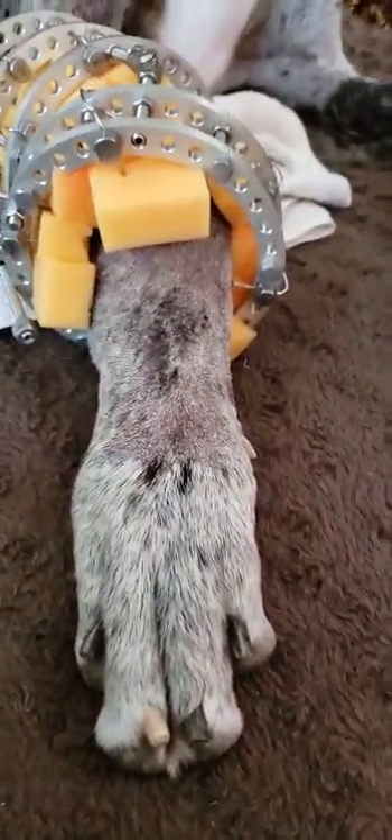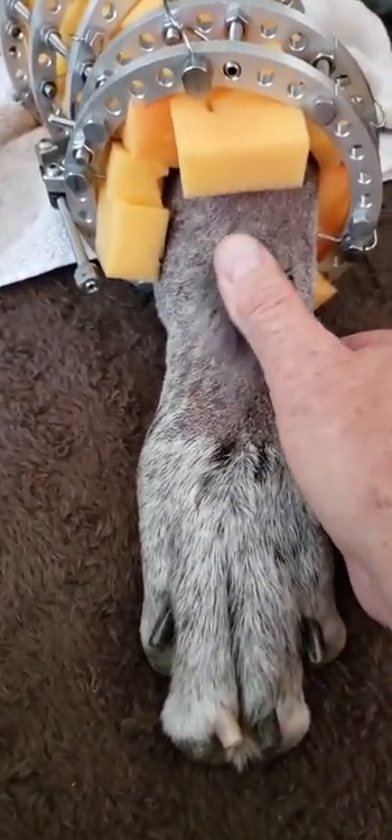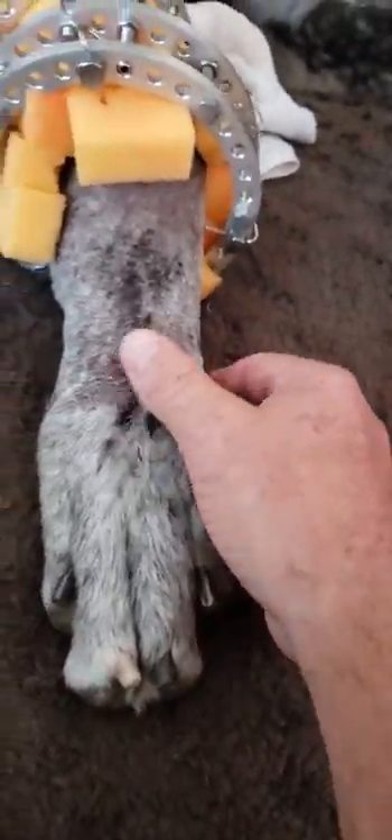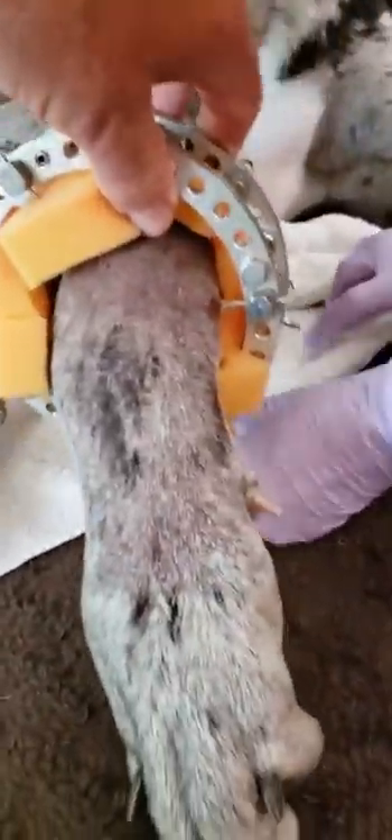His foot is smaller now — it was a lot bigger a little while ago. We have to sit here and knead all the fluid and push it all up towards the pins, and the pins just start dripping fluid out the bottom. Speaking of which, let's pick this thing up and put the towel under there.